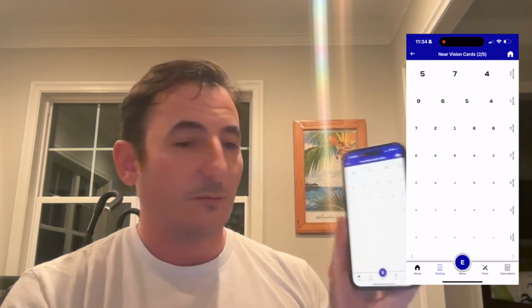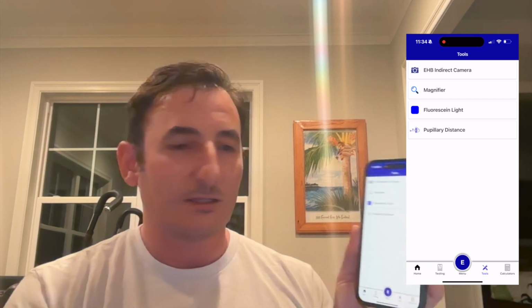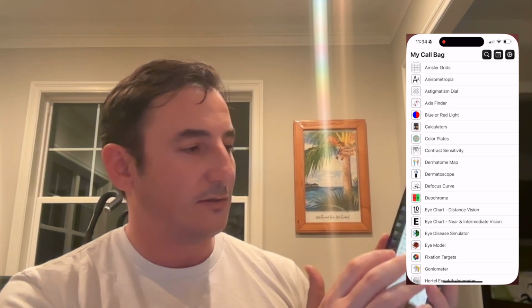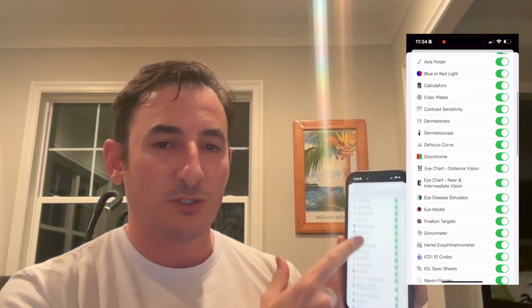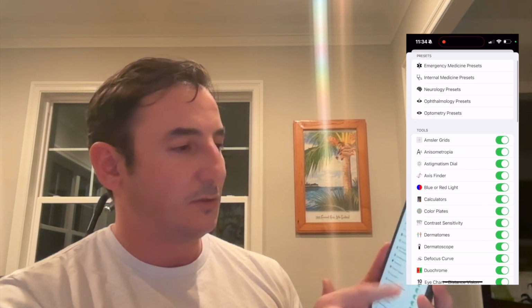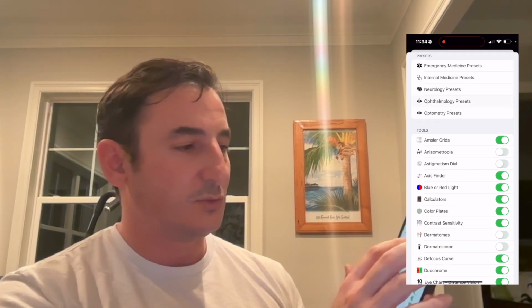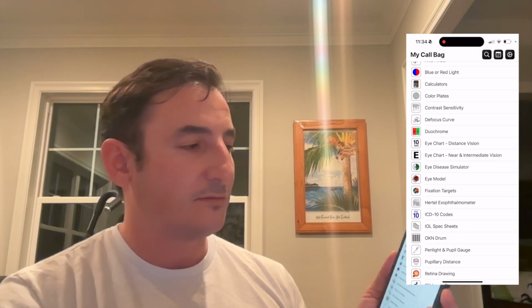That's pretty much it. Please explore the other tools on both the apps. Give me your thoughts on the differences. I'm really proud of what we were able to accomplish with the Near Chart app here, but there's a lot of other really cool tools. You can customize what tools you're using in the settings. So if you feel it's too many tools, you can quickly toggle off the tools you don't want to have. There's a lot of augmented reality things like the Hertel exophthalmometer, the pupillary distance measurement.